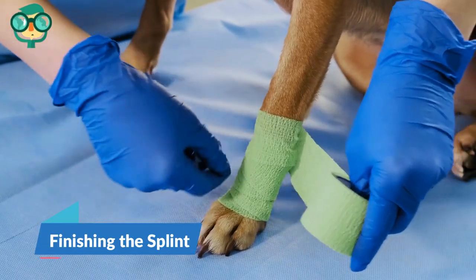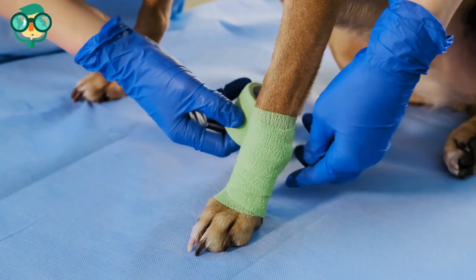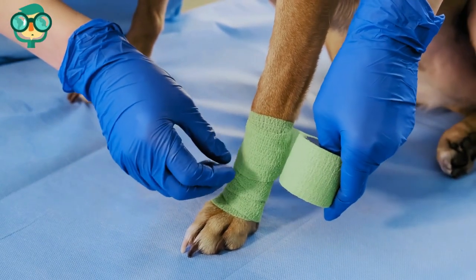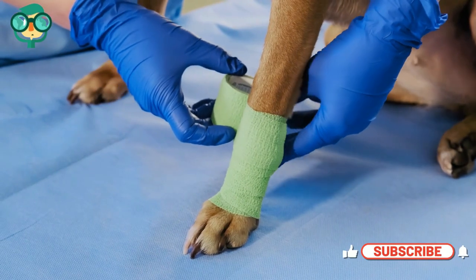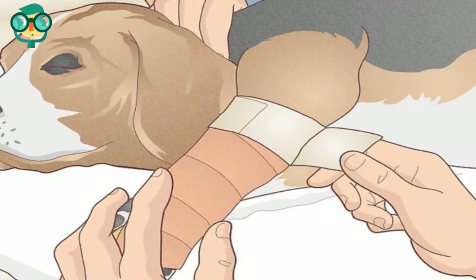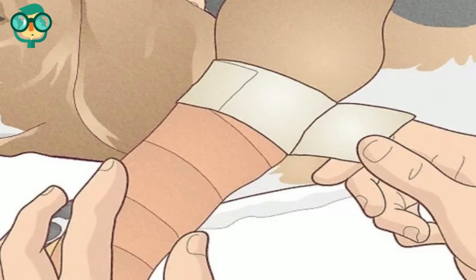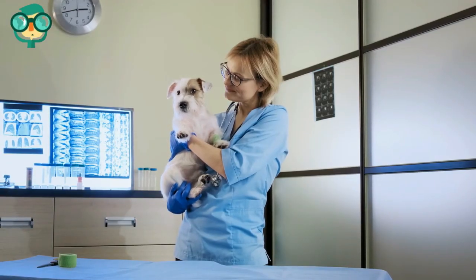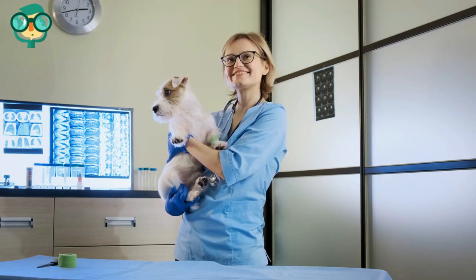The fourth step is finishing the splint. Apply a protective layer such as CoFlex to keep the bandage clean and rigid. Use elastoplast to prevent the splint from sliding off — most limb dressings have a habit of sliding off, so cut a length of adhesive dressing such as elastoplast to secure the top of the dressing to the limb. Now that your pup's damaged limb is supported in a splint, make your way to the vet.